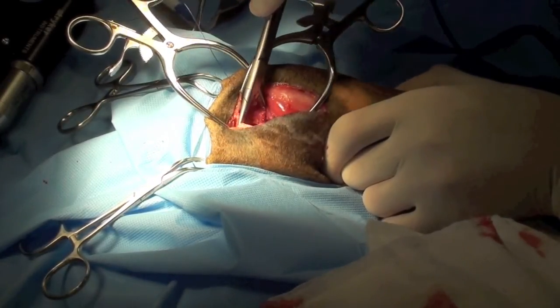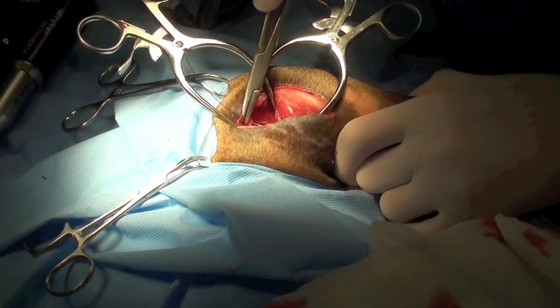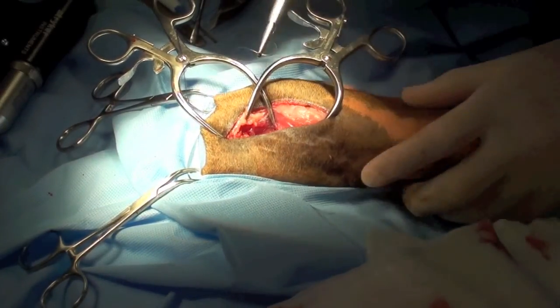Interrupted sutures are used to close the joint capsule. Ideally, the joint capsule should be closed over the acetabulum so there is no bone-on-bone contact between the femoral neck and the bone of the pelvis.